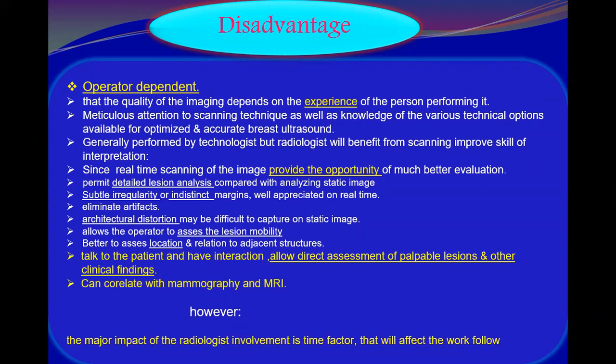Because there is an interactive process, you can better assess the location of the lesion by yourself and the relation of the lesion to the other structures. You will make sure how far the lesion is from the nipple, how the lesion is reaching the pectoralis muscle or the chest wall while you are scanning.